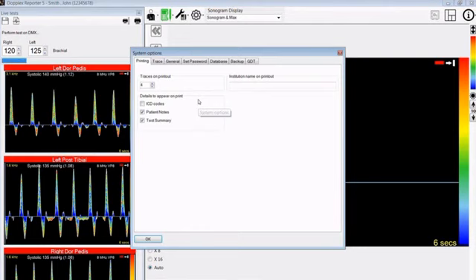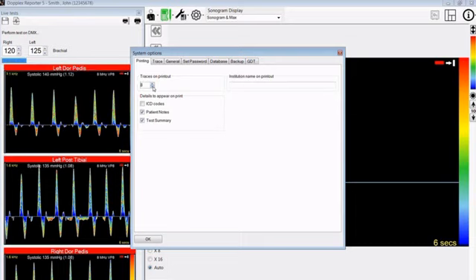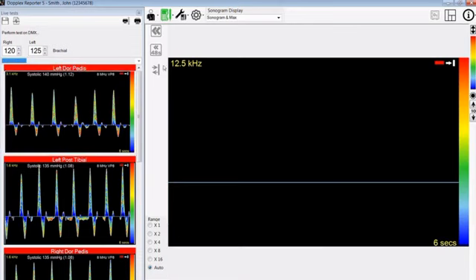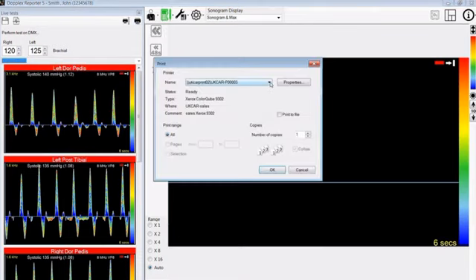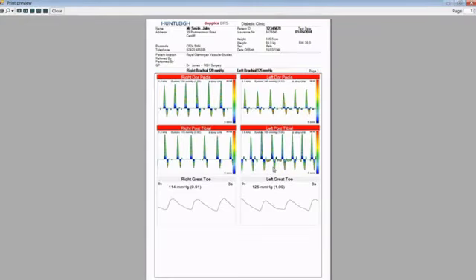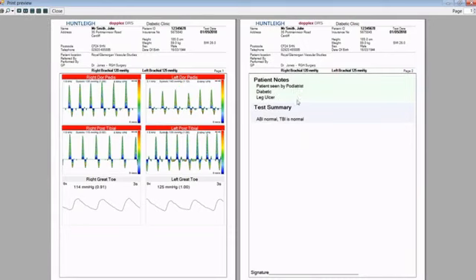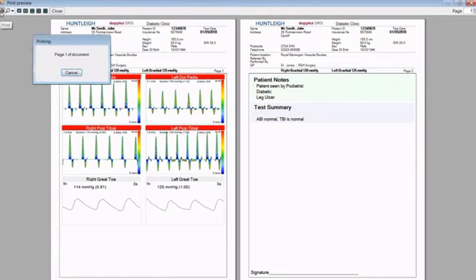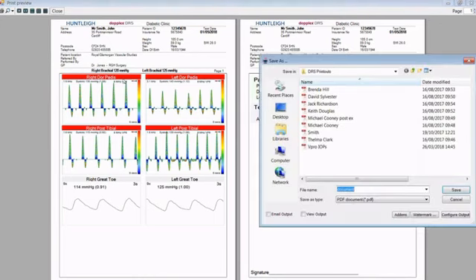We will select 8 in this case on the printout. You can also put in your institution name. Now we go to print profile again, select docu printer and press OK. Here we have PPG waveforms and the Doppler waveforms on page one of the printout. The second page will have the patient notes and the test summary. If we press print, this will go to a location that you select and these can be added to a directory location of your choice.